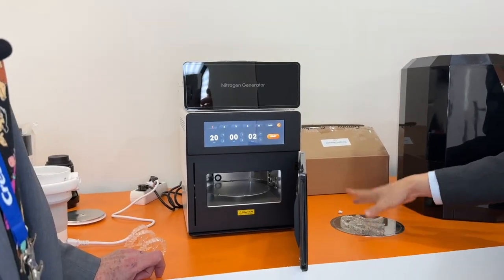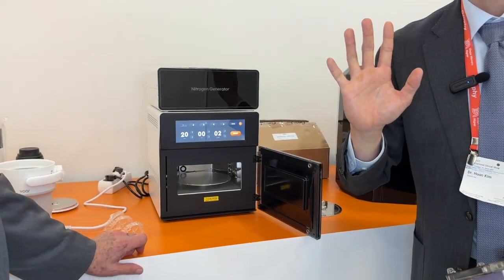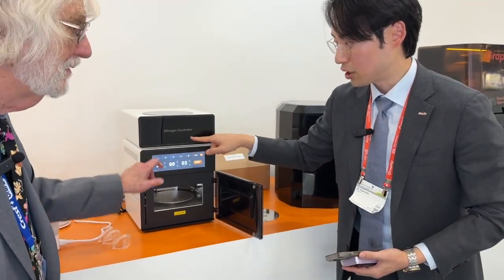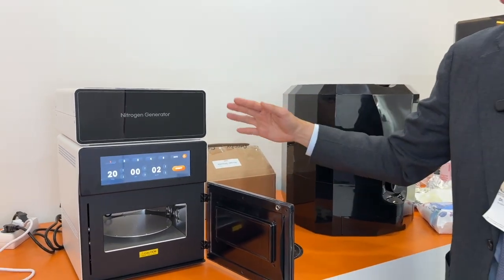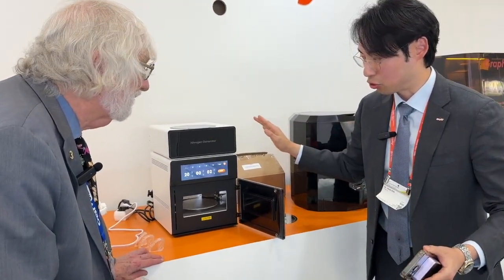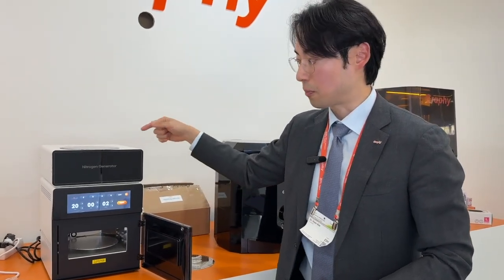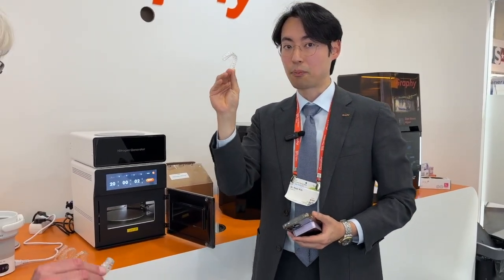Our aligner post-curing machine is special — ten times stronger than normal, and it uses nitrogen. The nitrogen is generated and filtered, and over six ATM of airflow is supplied. No nitrogen bomb — just using pressurized air supplied in there, with ten times stronger UV light to make a perfect first curing.